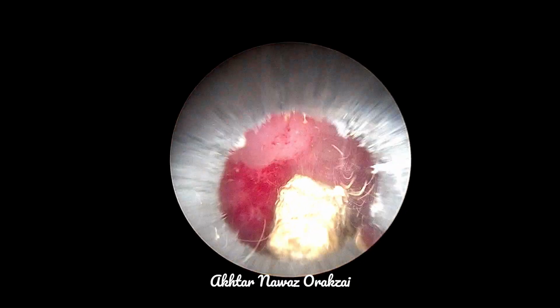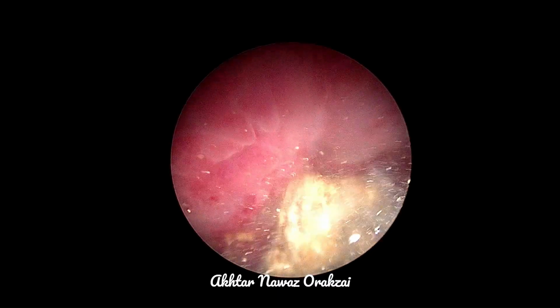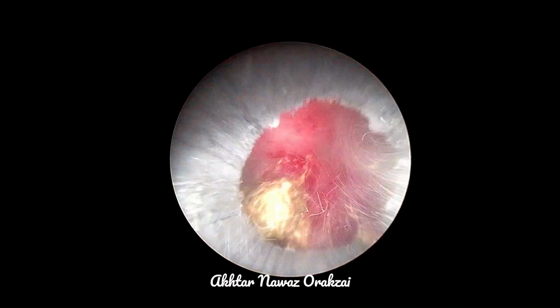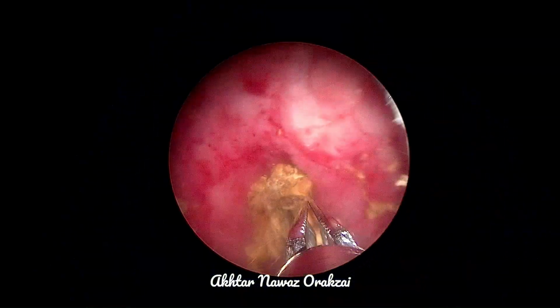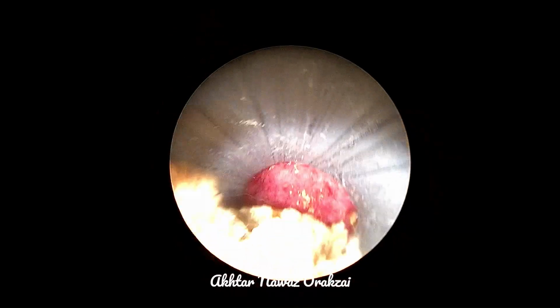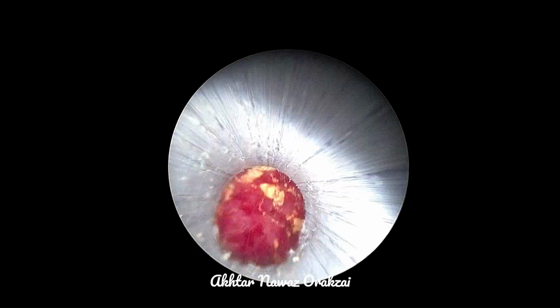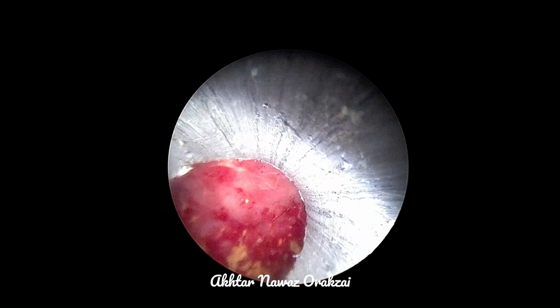So one large piece which would not come out through the suprapubic route is present, and that is being fragmented now. And removal of the perurethral catheter will depend on the indication of the procedure, the presence of urethral stricture or the presence of any bladder outlet obstruction in the form of enlarged prostate. Here you can see there are small diverticuli as well.